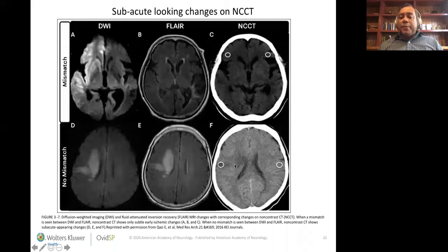So you can compare the attenuation characteristics of the lesion to the contralateral white matter and make a good sense as to what it means. Lower than the contralateral white matter would mean more severe attenuation and probably higher risk of bleeding.